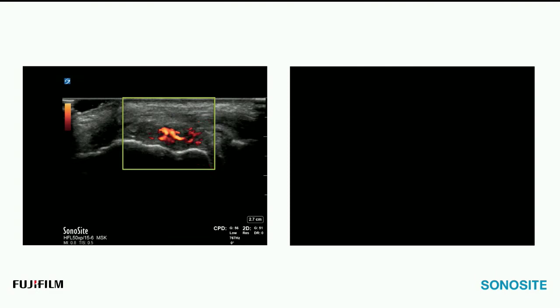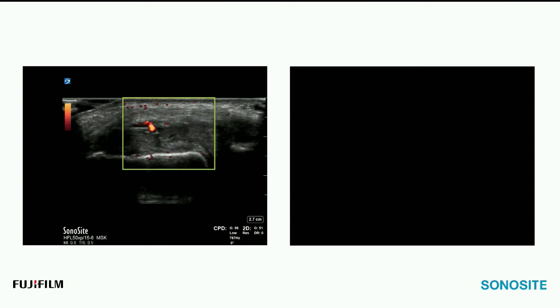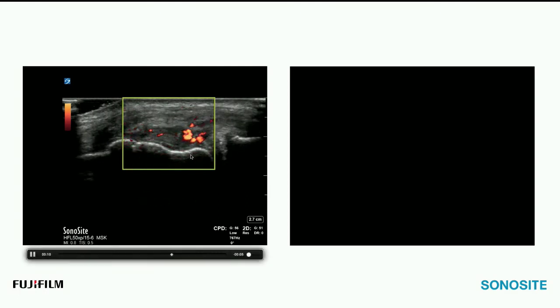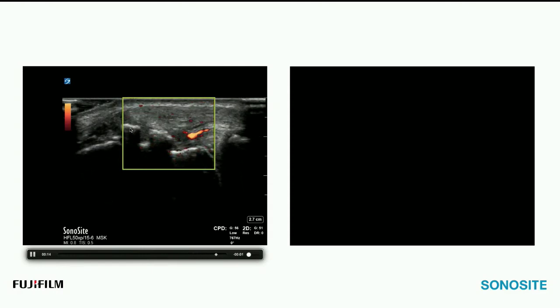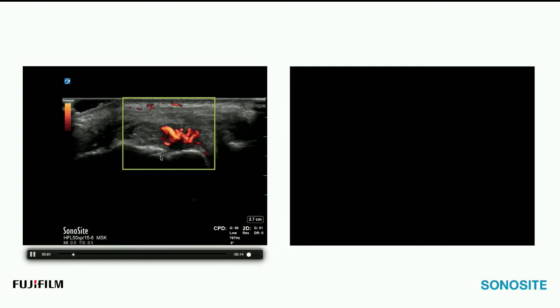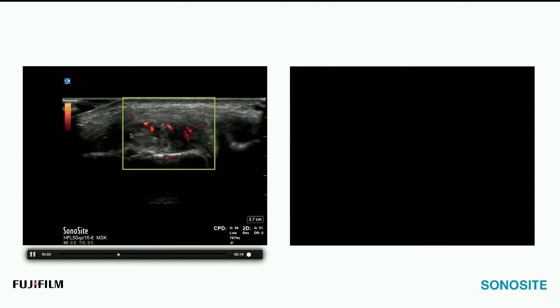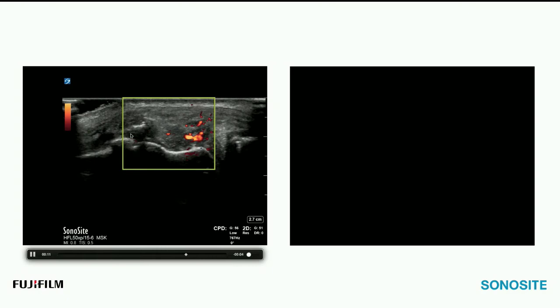So let's look at some pathology in that spot. Here we have a raging degenerative ligament change in kind of an oblique short to long axis here. But this is a really inflamed MCL. We do have cortical irregularities. We do have shadowing calcium deposits. So, other things to add to your clinical picture and aid in your diagnosis. Otherwise, it might not have been palpated or shown up on plain radiographs.